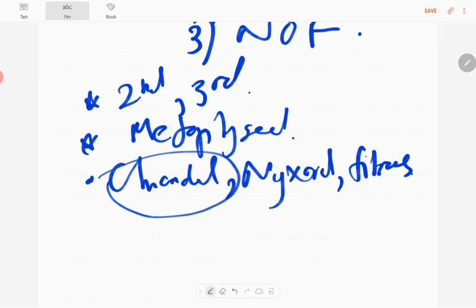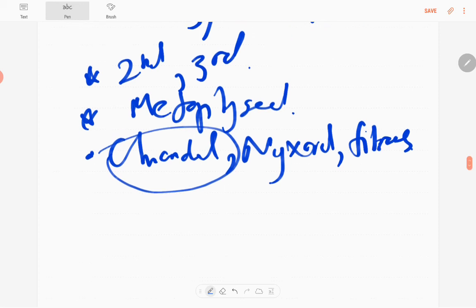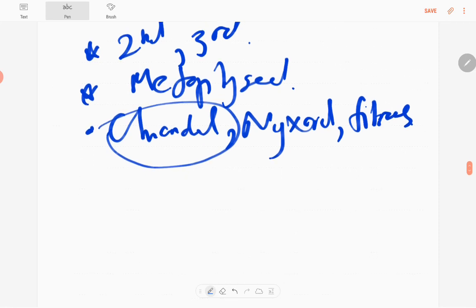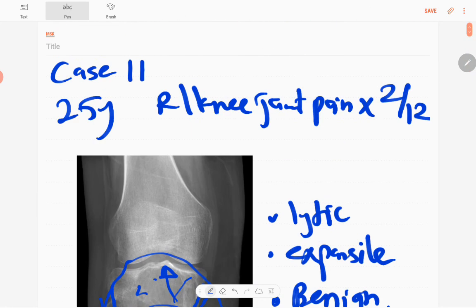They are commonly found in the upper one-third of the tibia and sometimes occur in the distal femur and small bones of the foot. It's a benign lesion. That concludes case number 11. Thank you everyone.